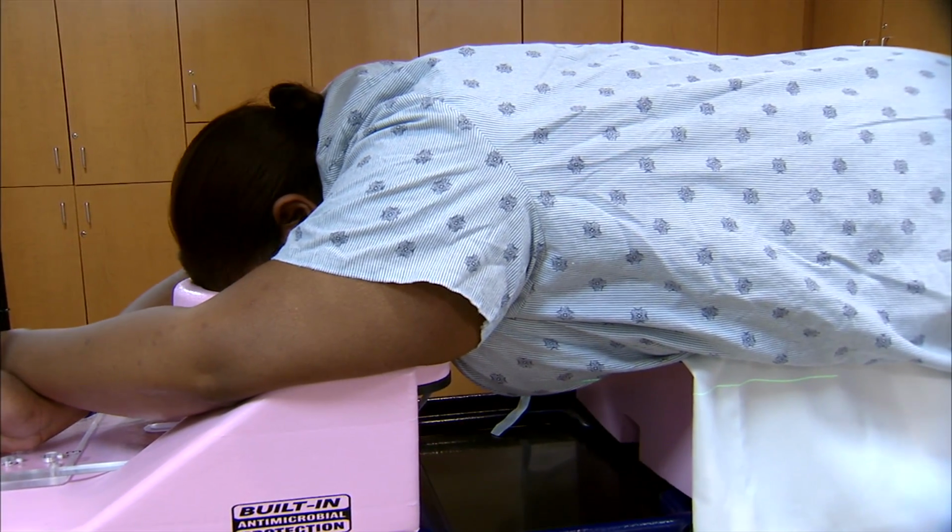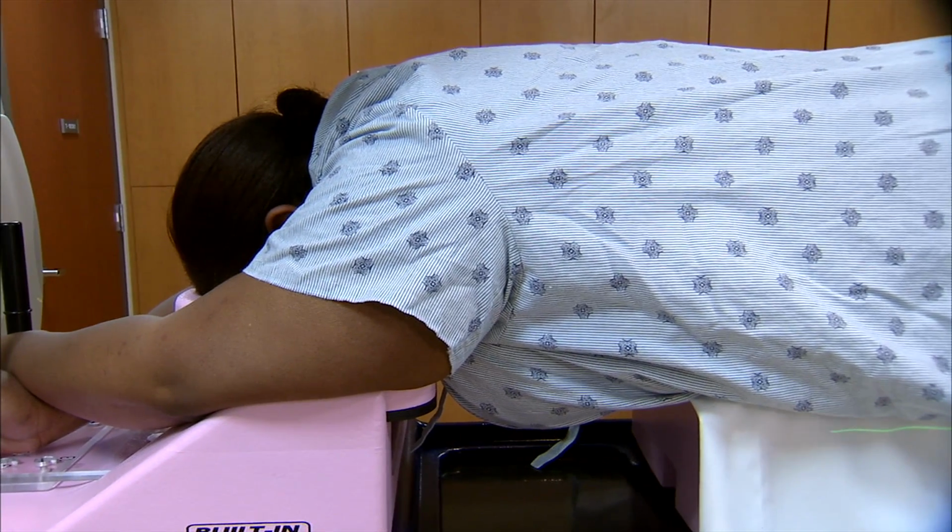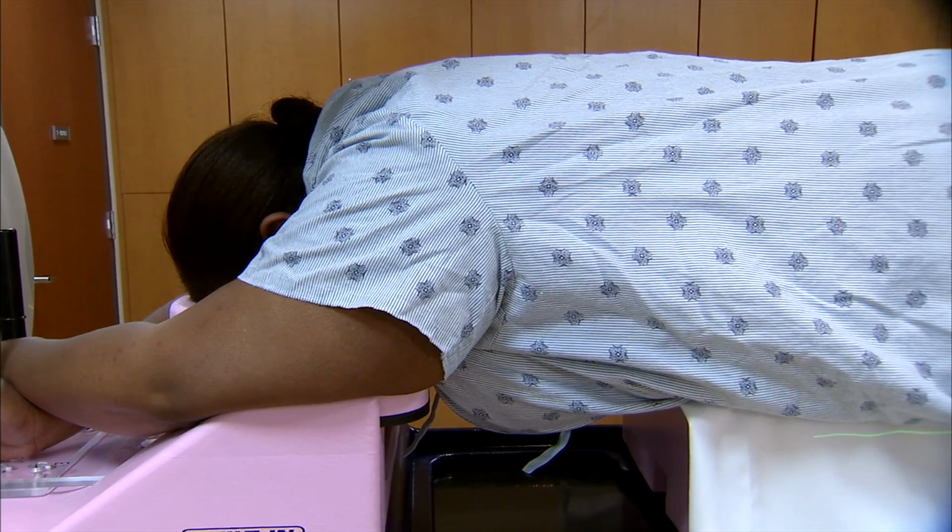A patient with very large breasts, where gravity plays more of a role in their life in general, we have them lay face down on this prone positioning table, and that way we let the gravity help us out by pulling the breast forward away from the body, and the right breast is held up out of the way, and we essentially treat them from under the table with those same straight, tangential radiation beams.